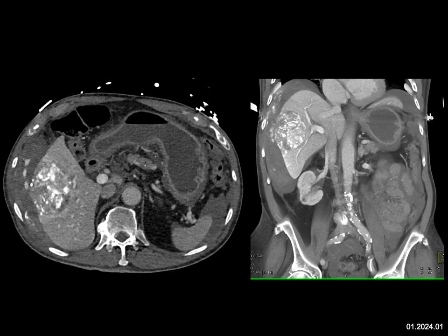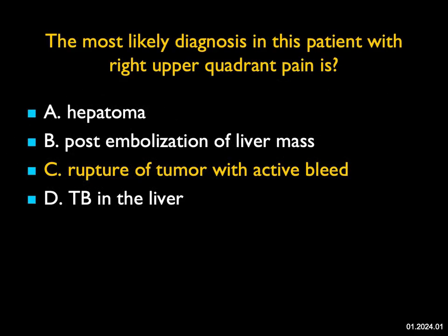There are a few correct answers here. Hepatoma — this was a hepatoma, and this patient did have post-embolization; you can see the TACE. The patient did not have TB — I put that in to fool you based on the calcification. But this was rupture of the tumor with active bleeding. A really terrific case.